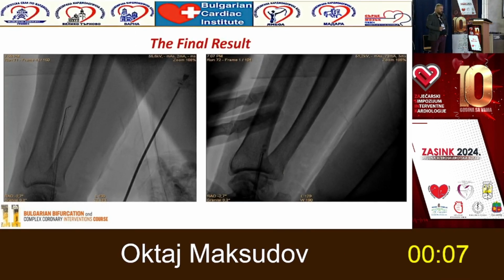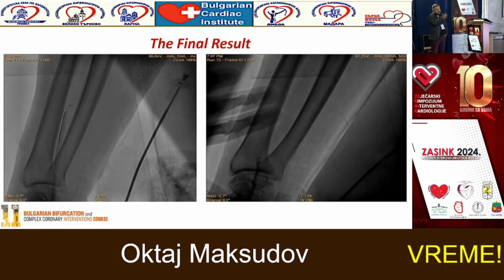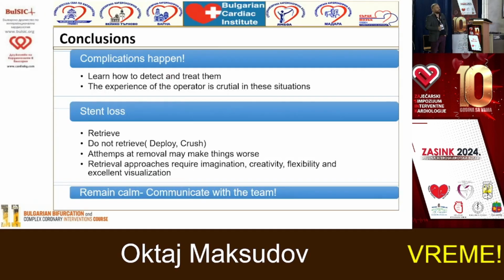We tried to pull away the piece of the stent that was left in front of the introducer. We tried with balloon, we tried with a couple of wires that go and make some kind of improvised snare, but we left a piece of souvenir over there.